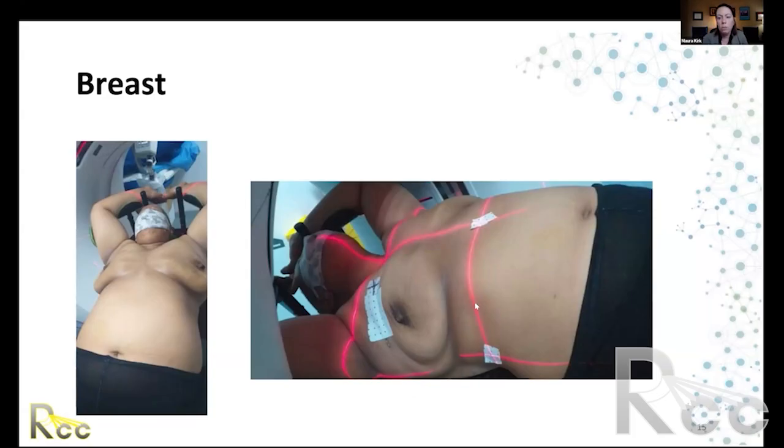And this also shows you an example where the patient might be marked at a stable location. Again, this may not be the practice everywhere, but I think that having this mark on the contralateral side is also a helpful starting point for your therapist when the patients first lie on the table, to make sure they're not rolled to one side. And then you may have an additional mark where they shift to for isocenter. But again, the marks on the breast are a less stable guidance point for you.